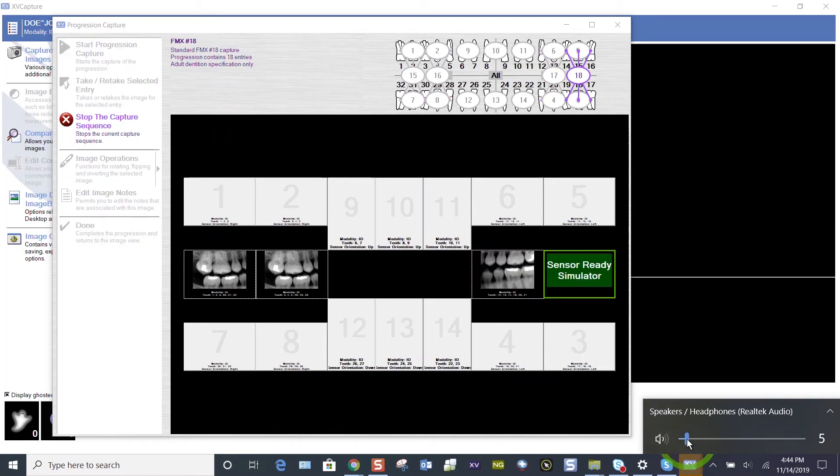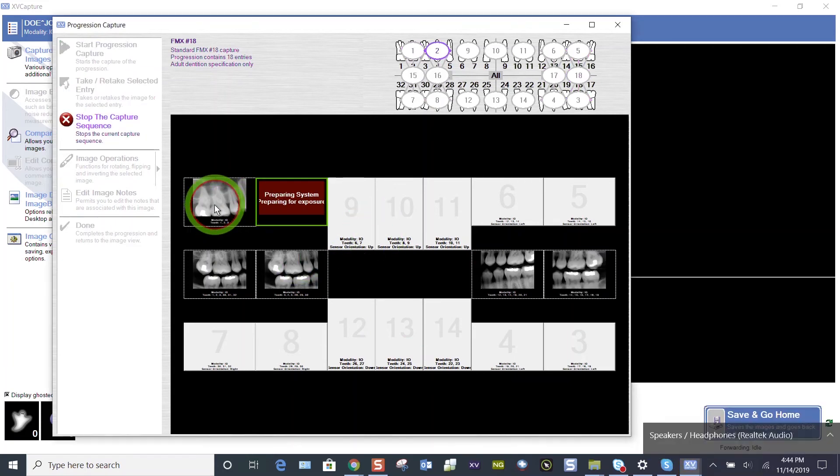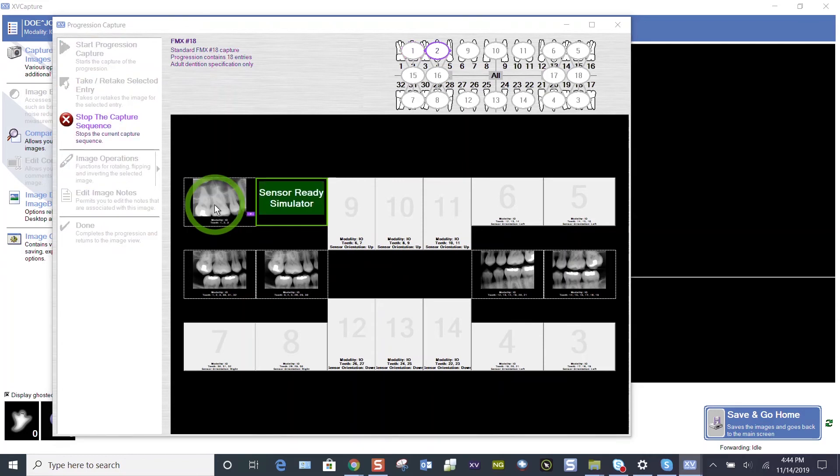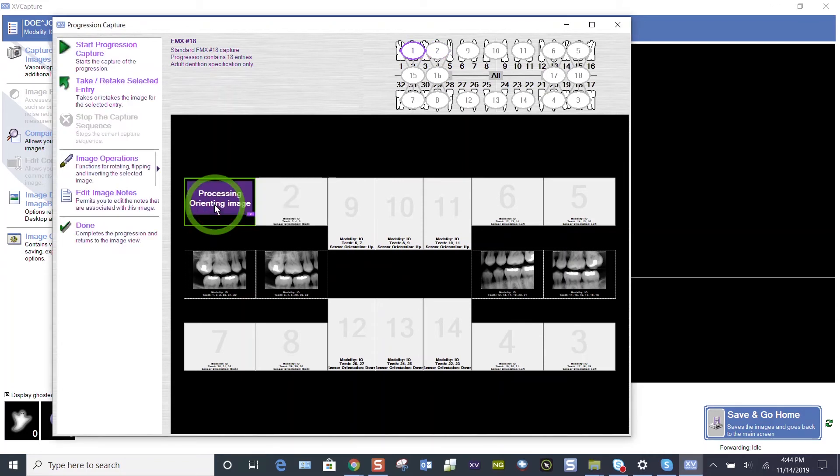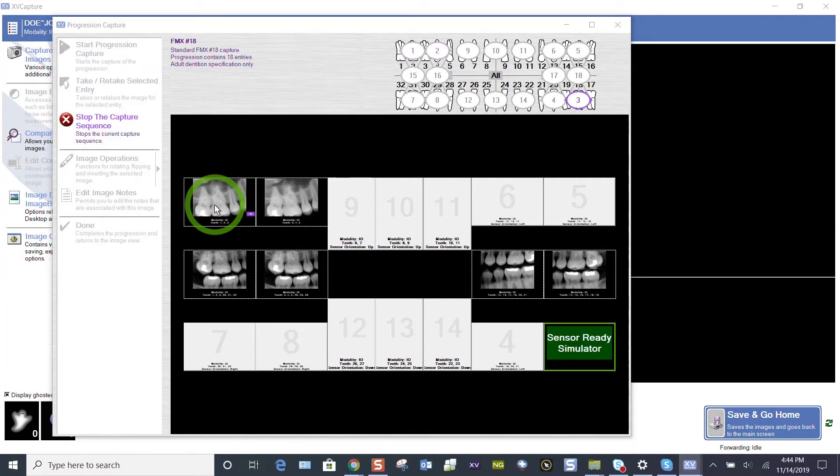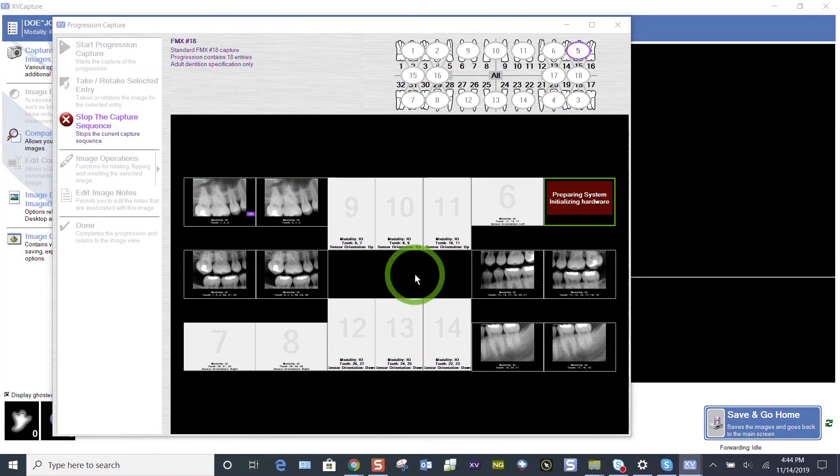Now, if you want to retake an image on the fly, this upper right molar, if it's not correct, I can highlight that tile, take my image again, hope I get the apex. If I don't, highlight the tile, take it again. And when I'm satisfied, it will move on to your next image. So it's that easy to retake an image on the fly. We're going to demonstrate that one more time.